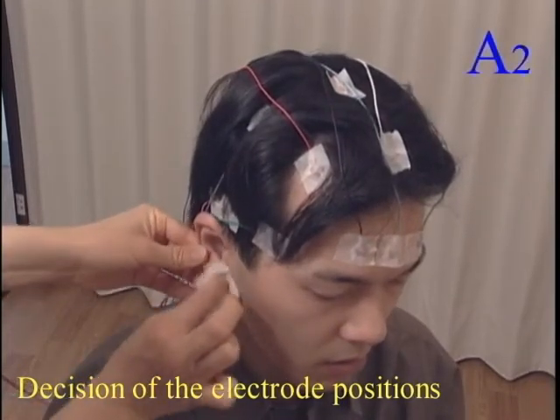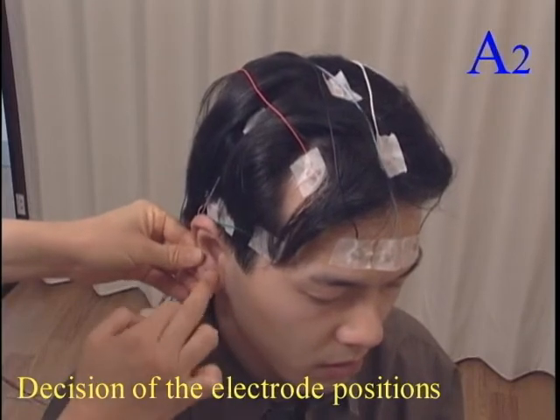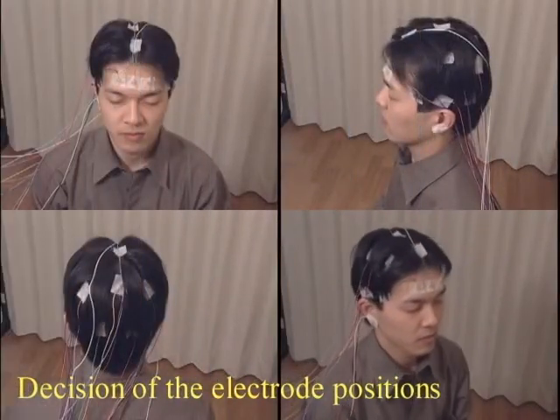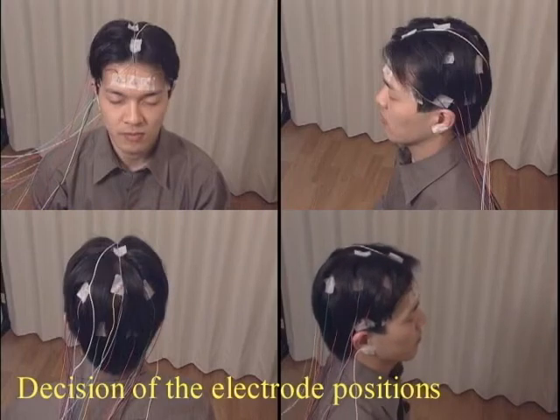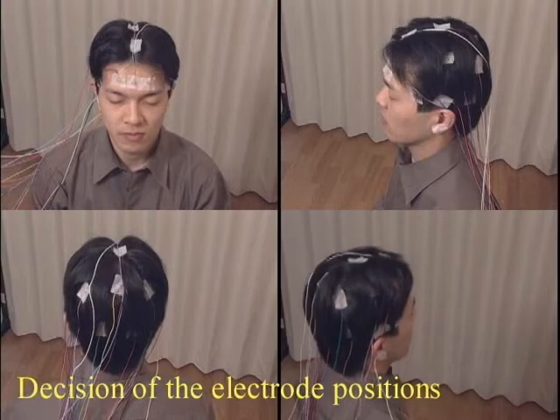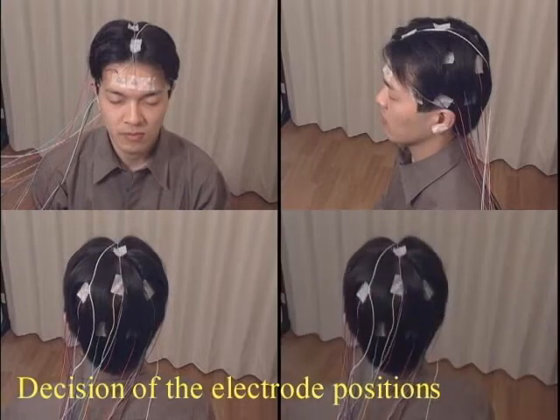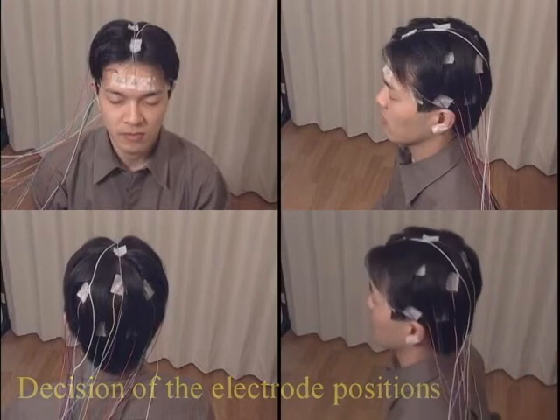Finally, attach the ear lobe electrodes. With practice, the whole electrode attachment will take about 10 minutes. When all the electrodes have been attached, verify that the electrodes are placed at the correct positions by checking for left-right and front-back symmetries. Also measure the contact resistance. When the value exceeds 20 kiloohms or is unstable, repeat the attachment from skin abrasion.